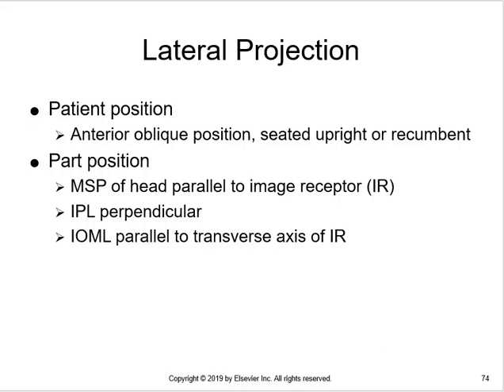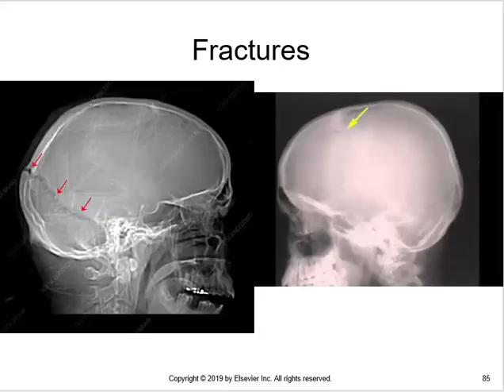To be completely honest with you, skulls have gone to CT, so we don't see a whole lot of actual skull work for trauma in diagnostic radiology, as they should, because so much can be going on inside of the patient's skull that we just cannot see. I don't mean inside of the skull as in skull fractures themselves, but rather inside of the cranium.